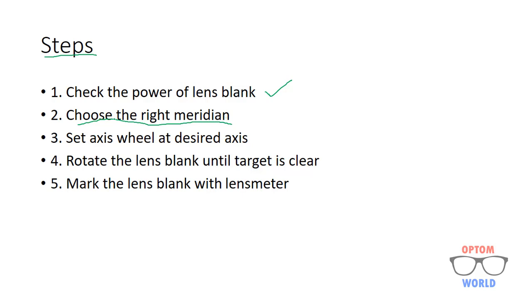The next step after choosing the right meridian is to set the axis wheel at the desired axis according to the prescription. Step number four is to rotate the lens blank until the target is clear, which means the lens blank is at the desired axis. The last step is to mark the lens blank with the lens meter.